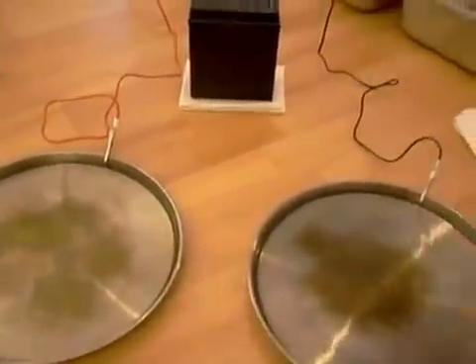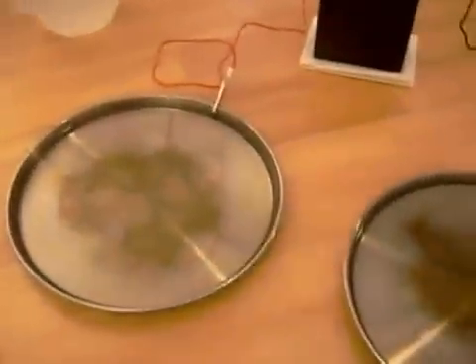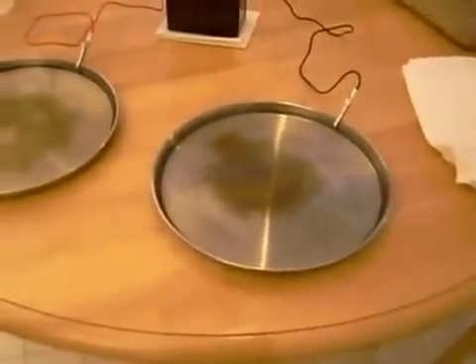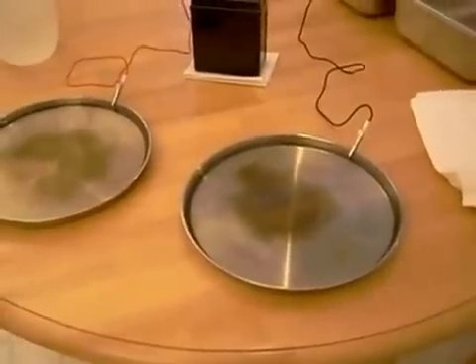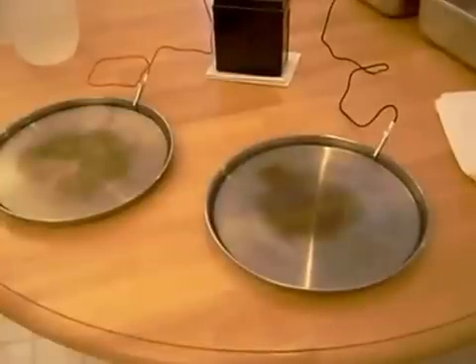The electricity will flow from this terminal through your body into this terminal. If you do this for about 20 minutes a day, three to four times a week, for about two weeks, you will notice a significant decrease in how much sweat your hands and your feet are producing.